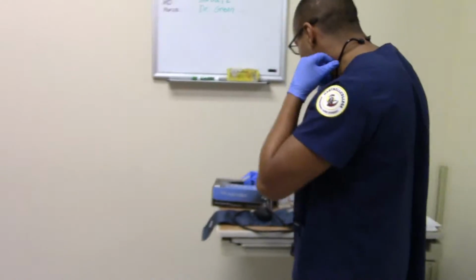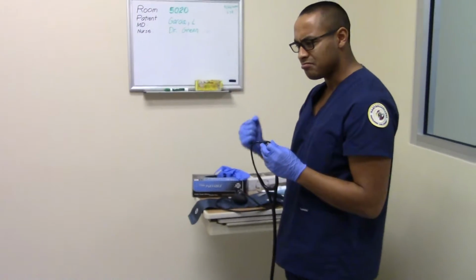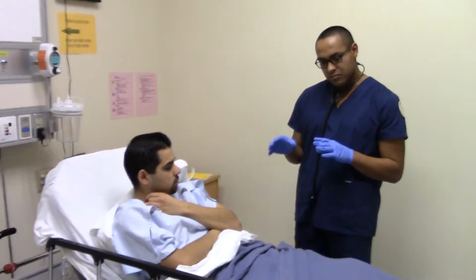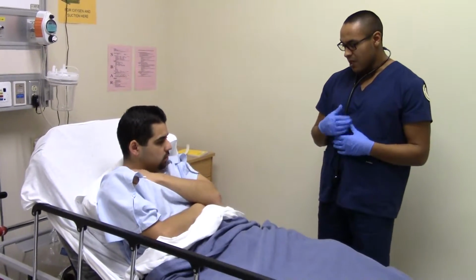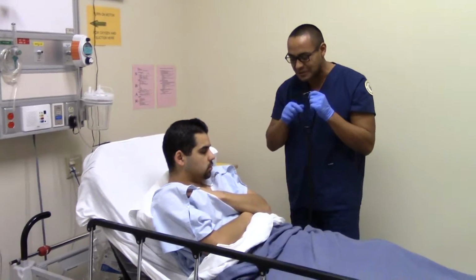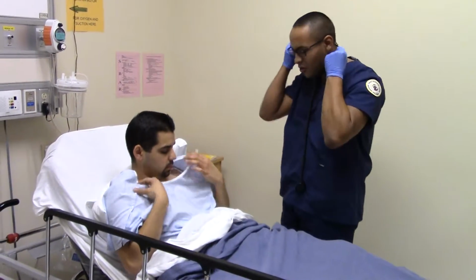Alright Christian, good. I'm going to go ahead and hear your lung sounds to see how strong they are, okay? I'll be checking your chest here, these spots, and your back as well, but also your heart. I want to hear your heart sounds, okay? Do you mind if I unbutton this? Sure. Okay, cool.